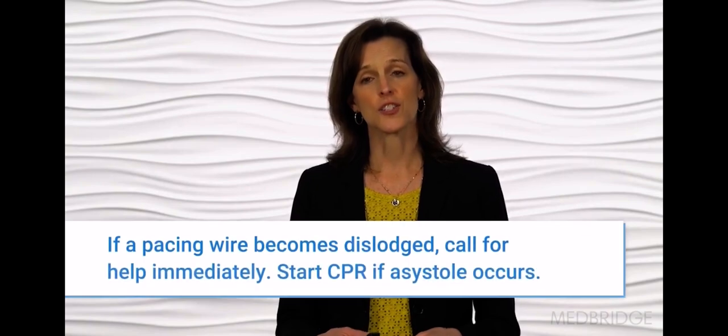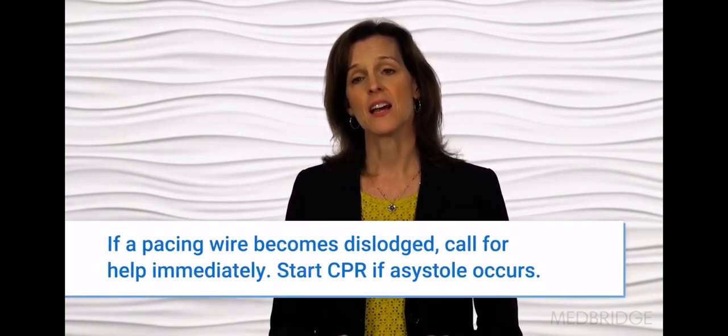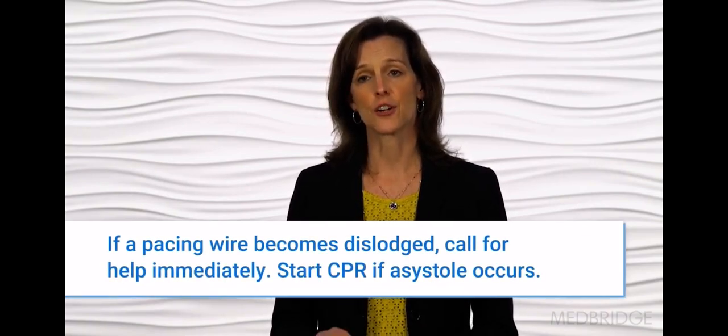If you are working with a patient with a temporary pacemaker in place, you want to ensure that you closely monitor the patient's ECG and blood pressure because some patients are dependent on their pacer. If this line is dislodged, you want to call for help immediately and start CPR if asystole occurs.